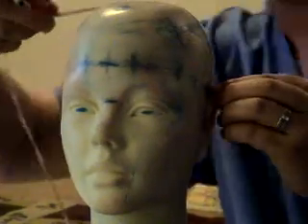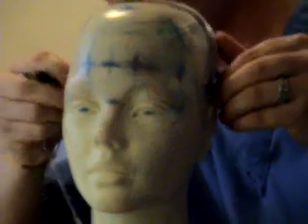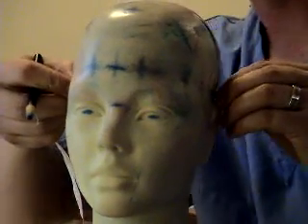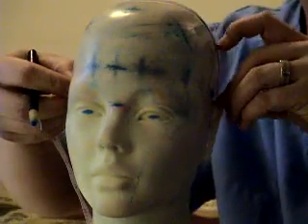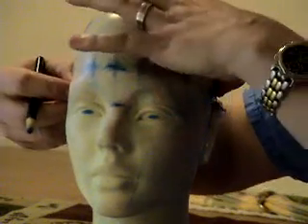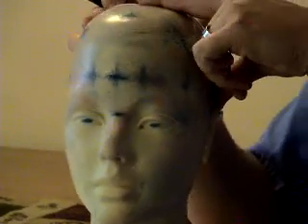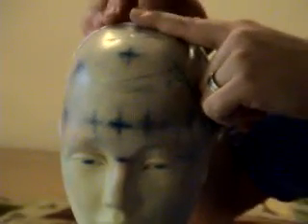Next thing we're going to do is the two marks that you just made above the ear. Place your tape and measure between them. That measurement is 24 centimeters. And it should coincide with the line that you've already made on the top of the head, which is CZ.